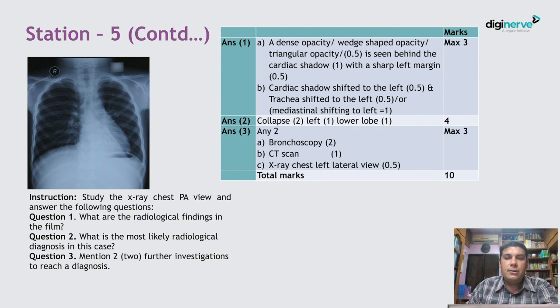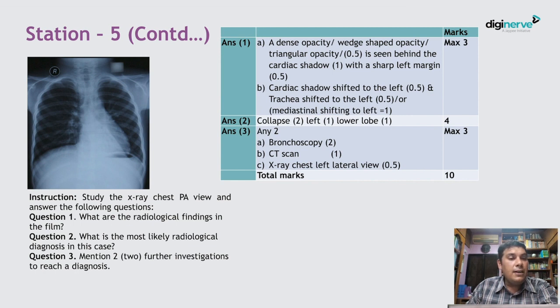The cardiac shadow is shifted to the left, and the trachea is also shifted to the left — a mediastinal shift to the left. This is an X-ray of collapse of the left lower lobe.